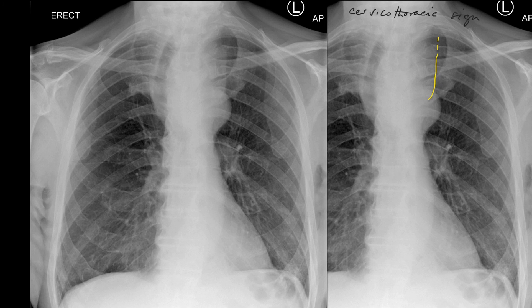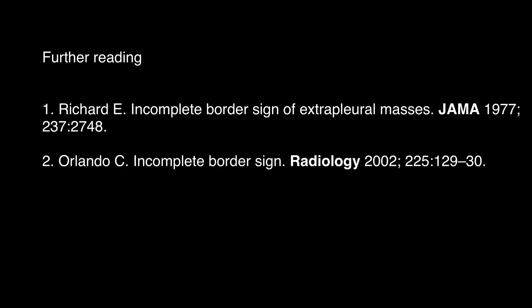It also demonstrates the so-called cervicothoracic sign, whereby the sharp margin is lost above the clavicle, making this an anterior mediastinal mass lesion.